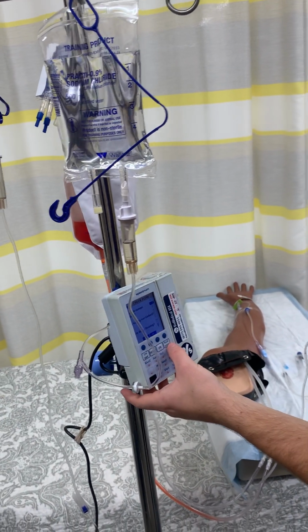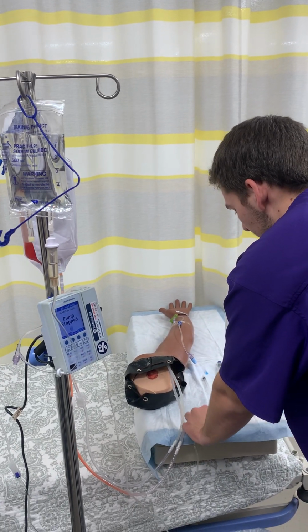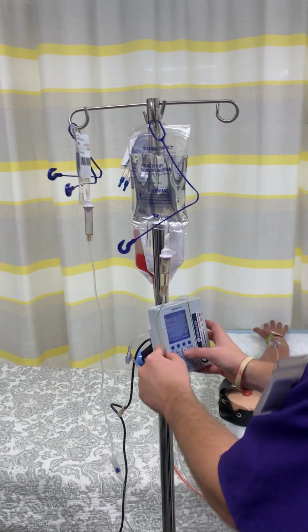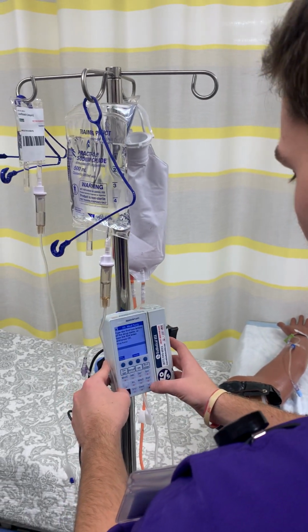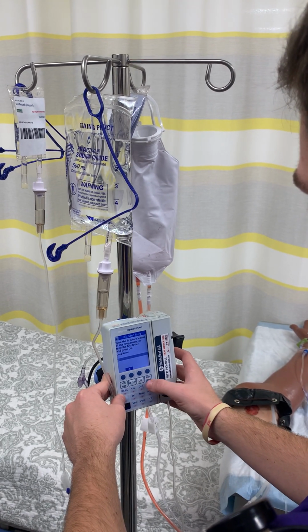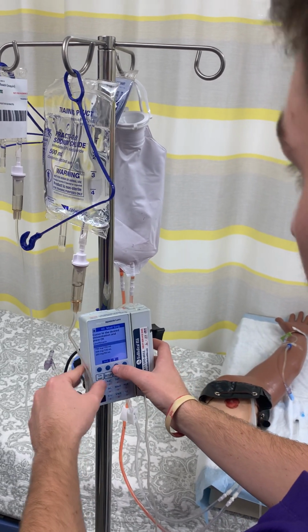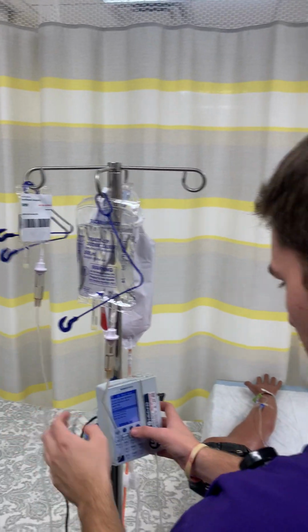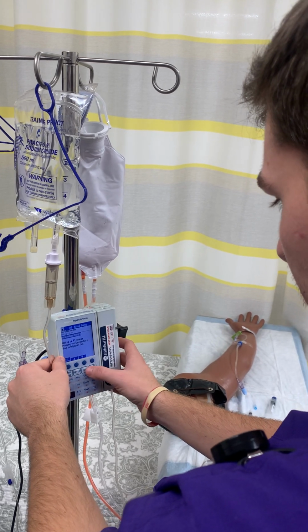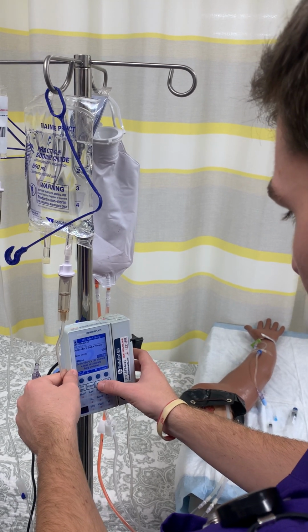So I'm actually going to stop it because we have to add another secondary bag. So I'm going to review and then add a secondary bag, and we're adding levofloxacin. So I'm going to type in that. And then this bag we know is 500 milligrams. And this is programmed into the machine, so we can just confirm that this is the size. And this is already in here, so I can just push OK.